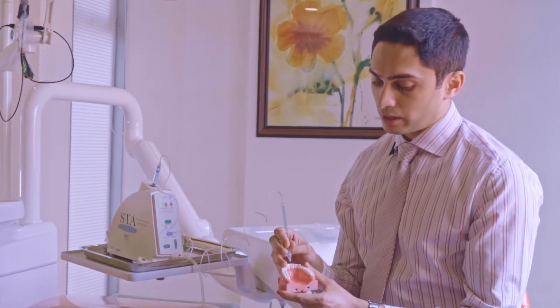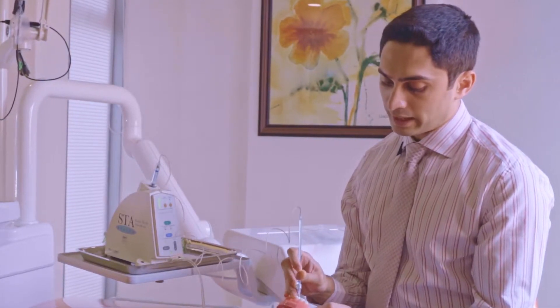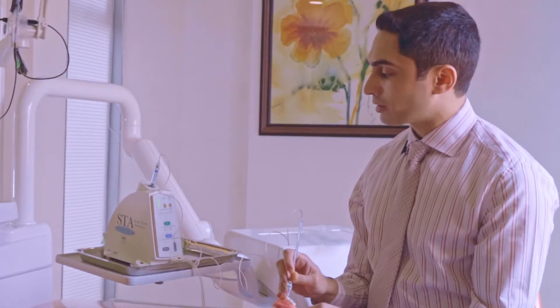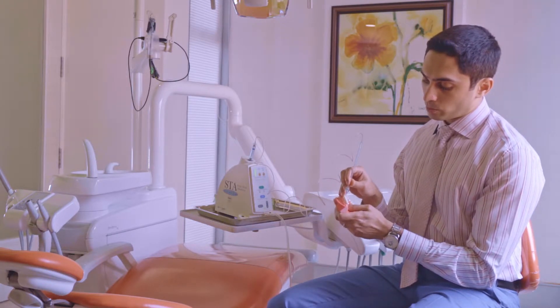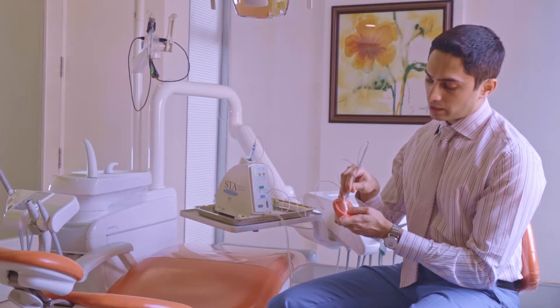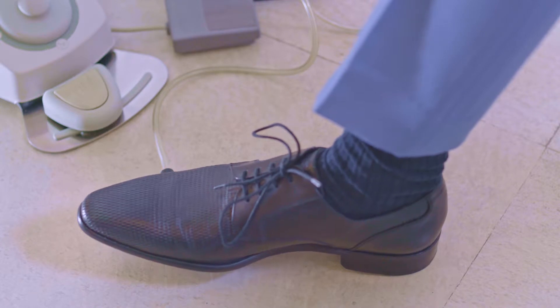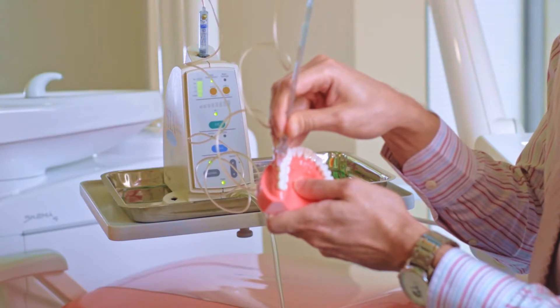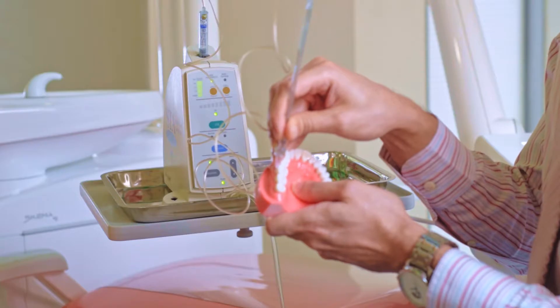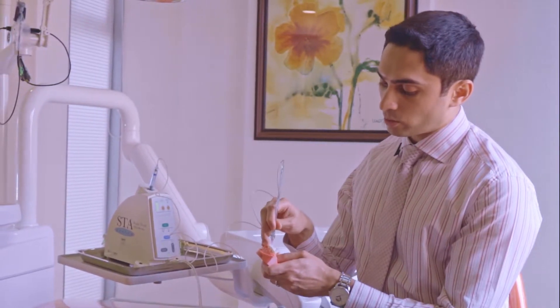To administer, you direct the device making sure the bevel is towards the tooth. For a maxillary molar you would be on the buccal and direct it at the appropriate angle. On a typodont we won't get tissue feedback, but you hold it straight, press the foot pedal, and the machine gives you feedback. When it says 'cruise,' you can let go and the machine does the rest of the work, delivering the local anesthetic effectively.